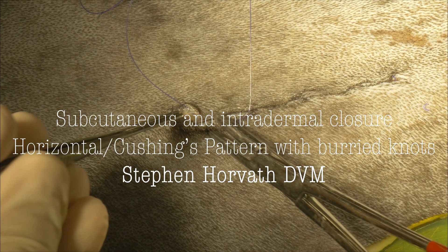In this video, we're going to discuss subcutaneous and intradermal closure using a horizontal Cushing's pattern with buried knots.